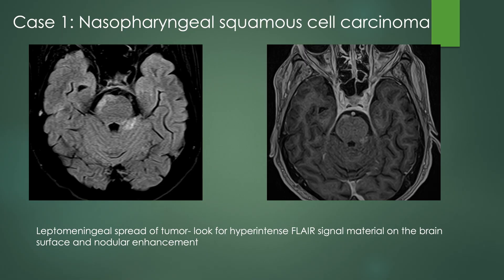Case one: this is a patient with a history of nasopharyngeal squamous cell carcinoma. You're looking for hyperintense FLAIR signal on the surface of the brain, especially if you see it with nodular enhancement. On this FLAIR sequence, we see subtle hyperintensity along the surface of the pons and along the cerebellum. On the post-contrast images, we can see subtle nodular enhancement in these same areas. This was leptomeningeal spread of nasopharyngeal squamous cell carcinoma.